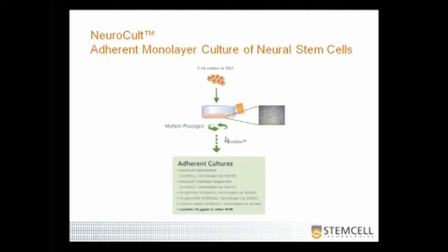The cytokines EGF, FGF, and heparin cofactor were included in the media. The cells were detached at each passage with Accutase. The resulting cells from the adherent cultures were analyzed for their functional properties.